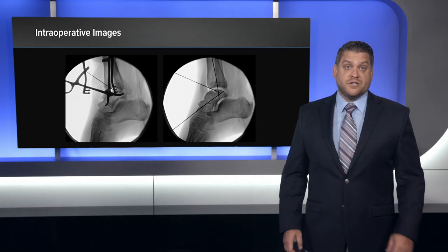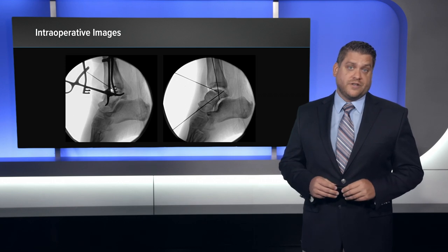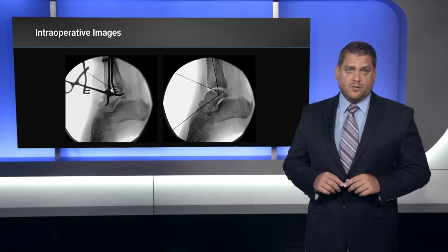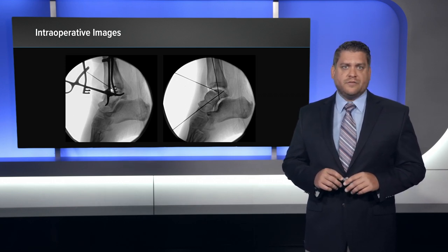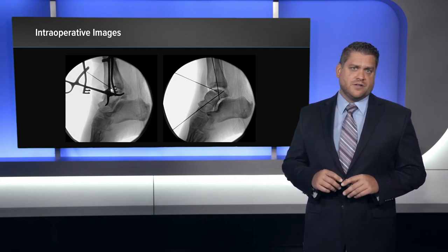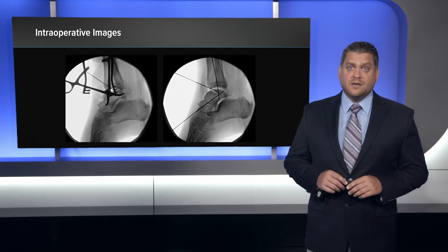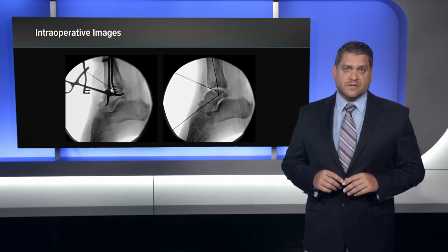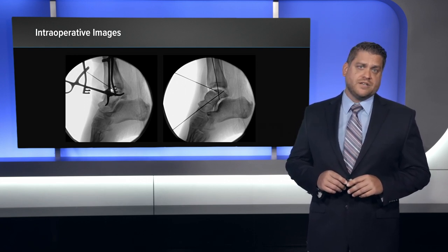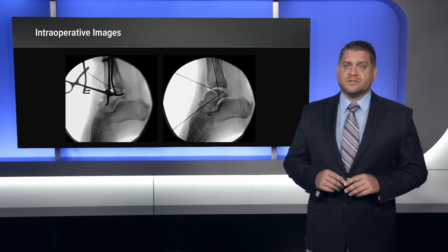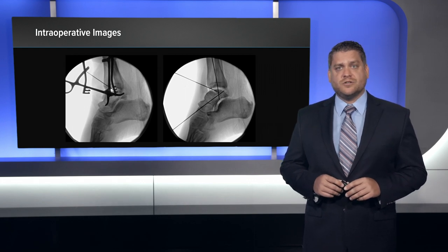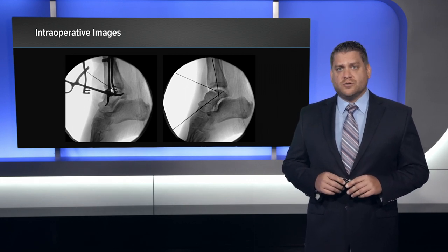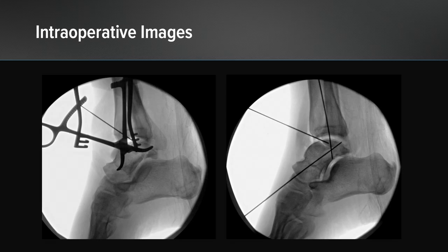Here we have progression of fixation with reduction of the different osteochondral as well as isolated chondral fragments. Clamp fixation as well as provisional K-wire fixation is used to reduce and provide stabilization for the talar body as we look towards definitive fixation.